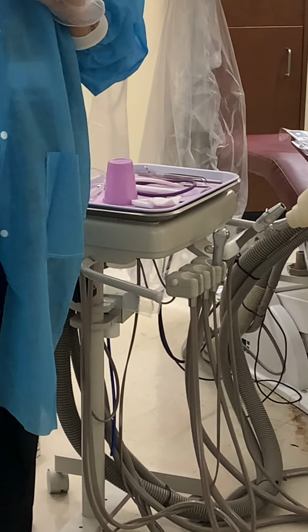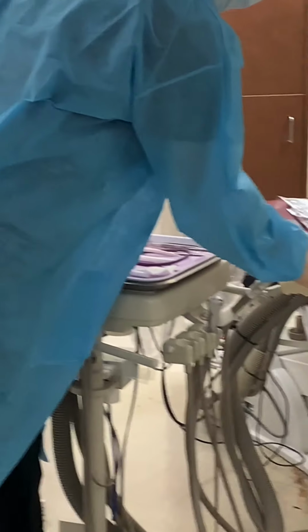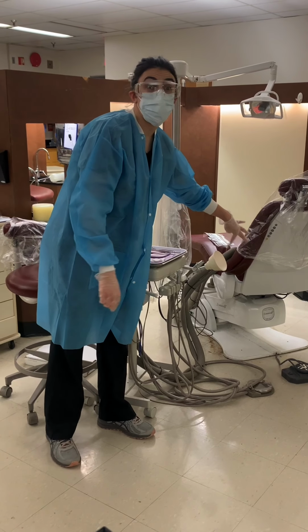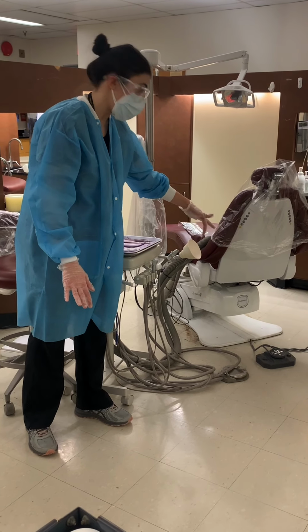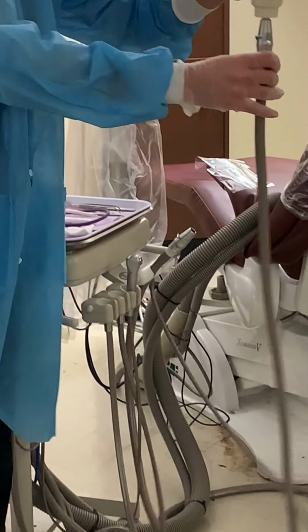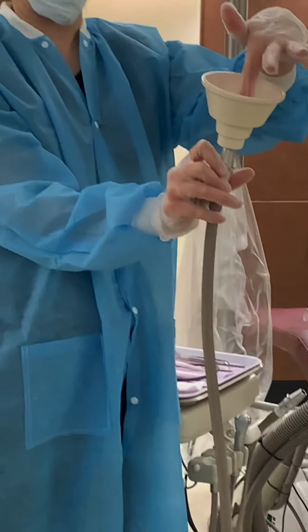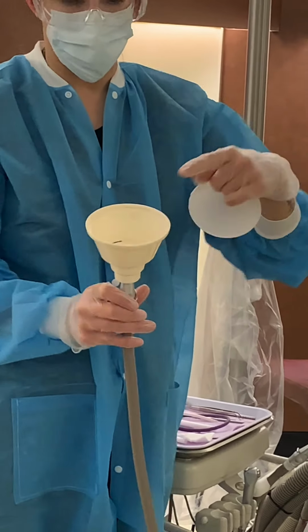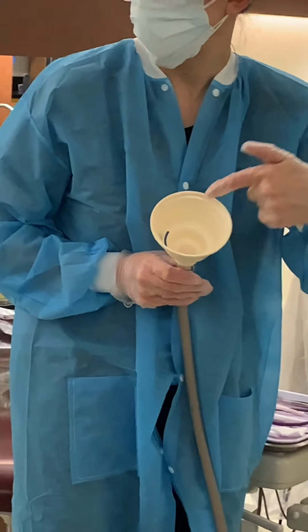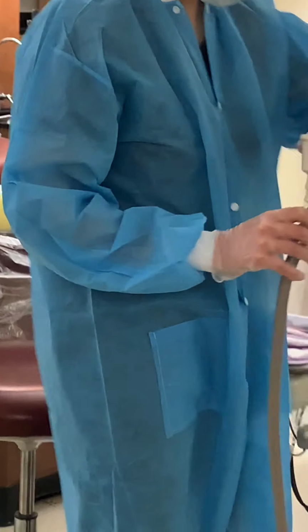This is a form of infection control. So this is something that you would put here that gets switched out every patient. And then of course you would still need to wipe this. I mean, when I'm going to wipe the unit, you'll see we're going to wipe that as well, but this is so that the spit goes through this little paper and goes right down. And again, it's all about eliminating the bacteria in those little nooks and crannies that are really hard to clean. So we like to cover the little nooks and crannies.